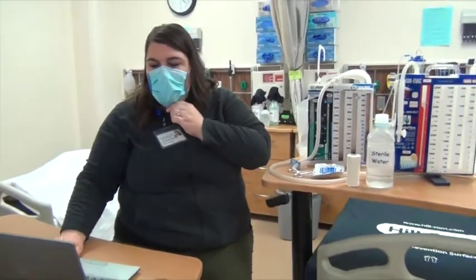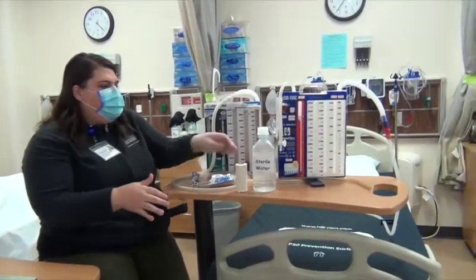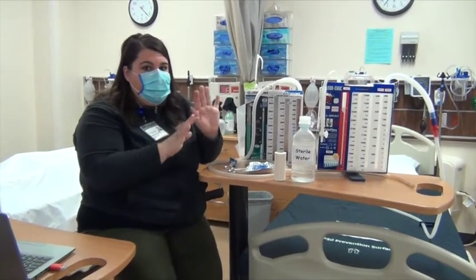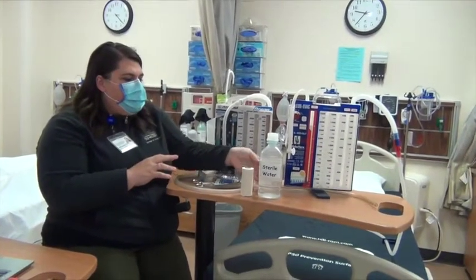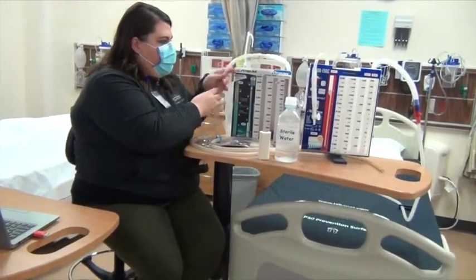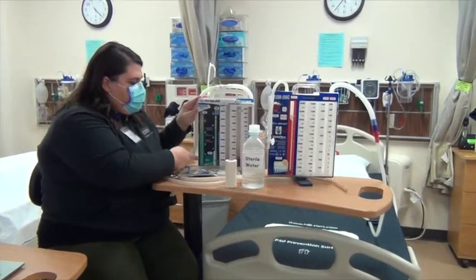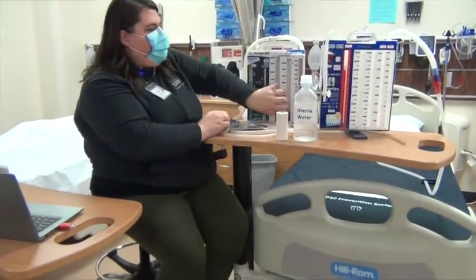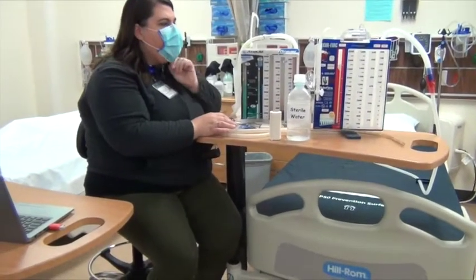Other things to note when you're assessing, you're always going to start from the patient and work your way down. So you're assessing the site, you're assessing for crepitus or subcutaneous emphysema to make sure there's not an air leak around the site. You're assessing the dressing and the insertion site. You're assessing all of your connections. You're going to work your way down the tubing to make sure these connections are good. You're going to check for air leaks. You're going to check to make sure that the suction is where it needs to be. And then you're going to assess the drainage, both in the chamber and then for the amount and in the tube for color and consistency.